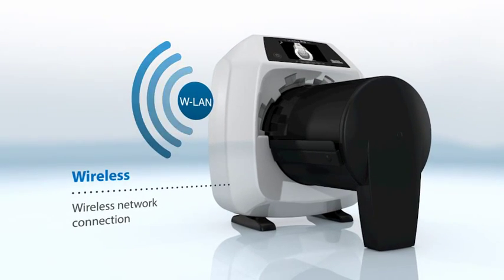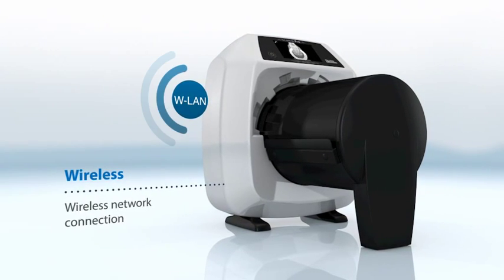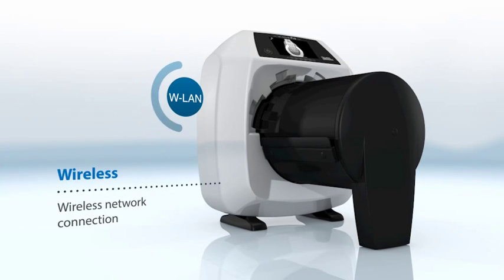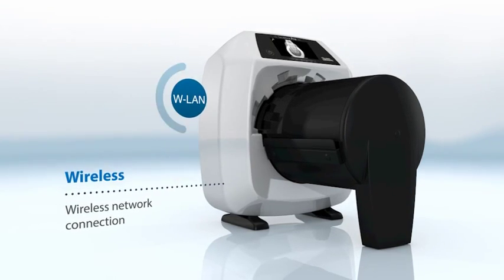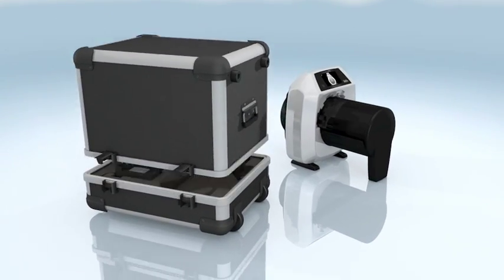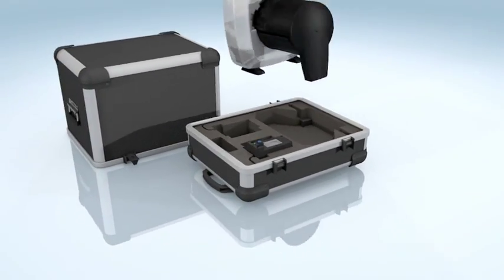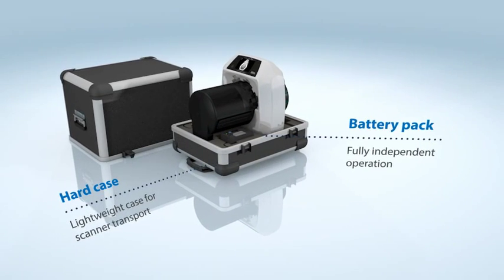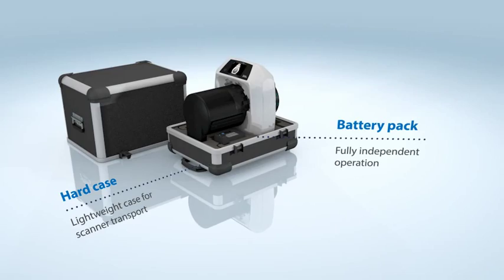An additional feature is the embedded Wi-Fi module that allows easy integration into an existing wireless local area network, offering true mobility. An optional carrying case provides protection and can accommodate a battery pack that allows the device to operate untethered away from the office for up to a full day.